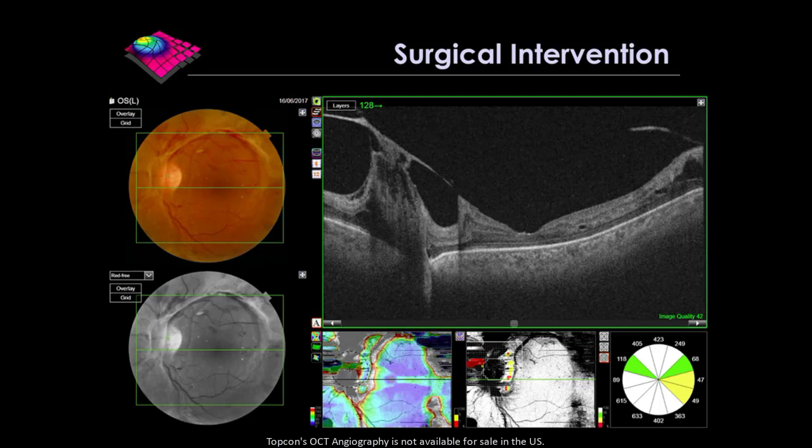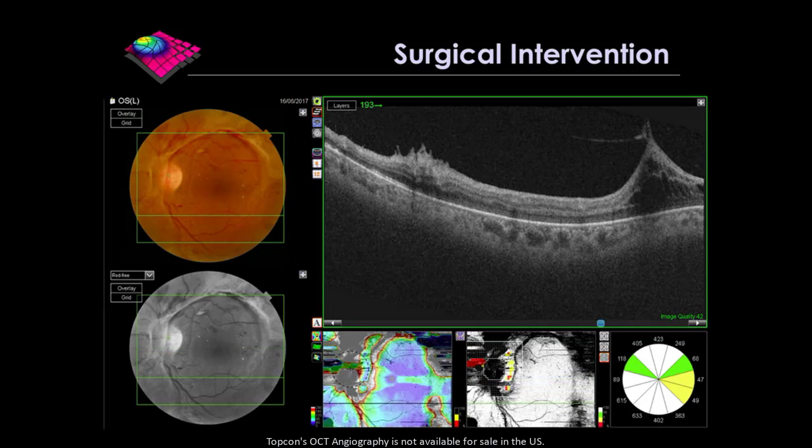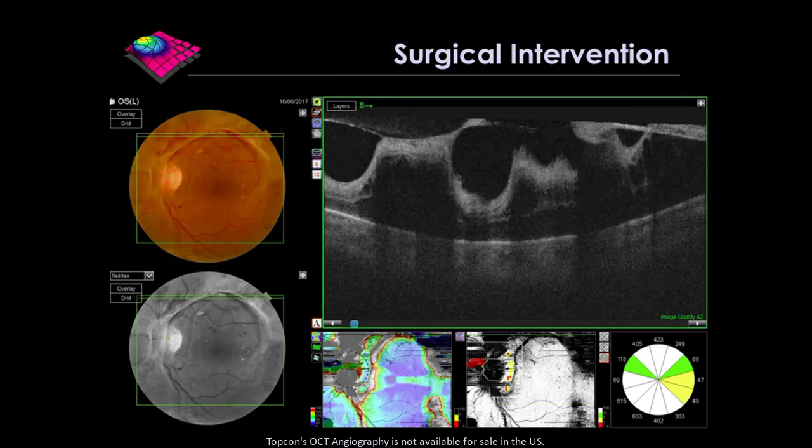So this unfortunate woman presented with bilateral tractional retinal detachments. And what I want you to pay attention to here, and actually it does look so much more dramatic on the red free images, is have a look at her fovea. Vision is 6/9 in this eye, and actually her fovea looks okay, relatively speaking, of course. Now we look at some other cuts, and you can see this traction element down here below the optic disc, and then above you can see multiple areas of pulling on the retina. So just try and remember how she looks now.